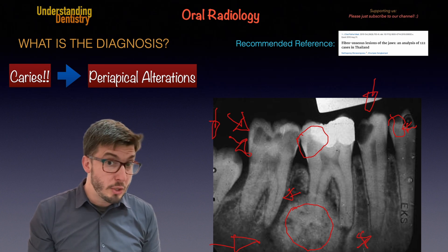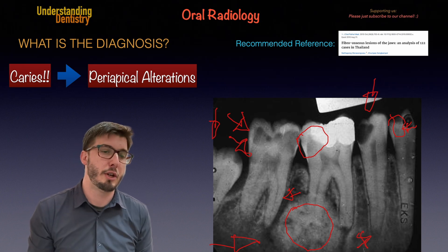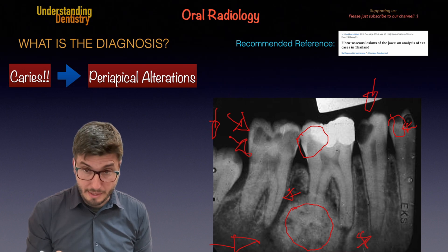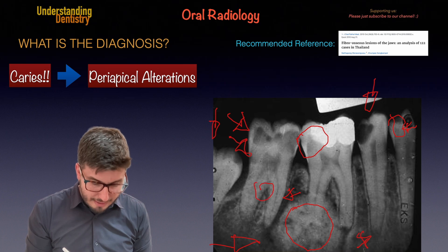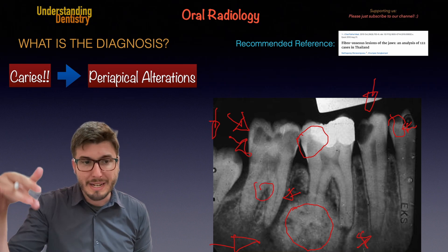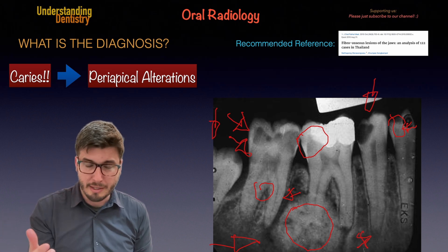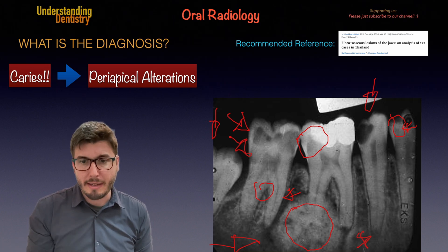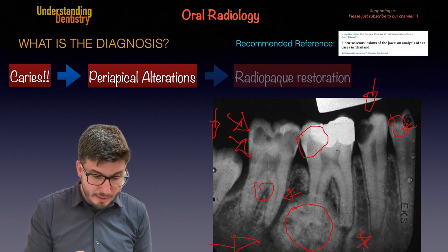If you guys are wondering if this could be cervical burnout — well, not really, just compare to the other side. This is not the pattern of cervical burnout for this patient. We also have an image suggesting resorption of the bone at the furcation, so probably the buccal aspects of the furcation would be exposed. Maybe not fully exposed at level 3, but we would most likely find a furcation exposure here.